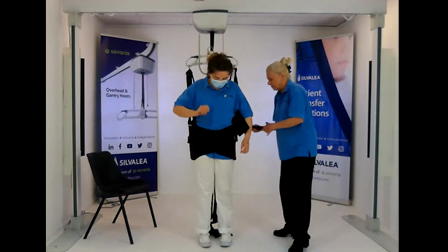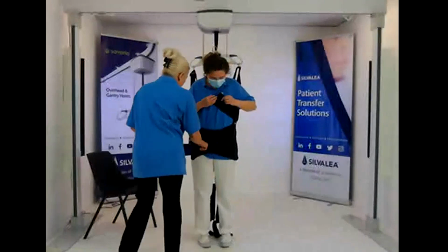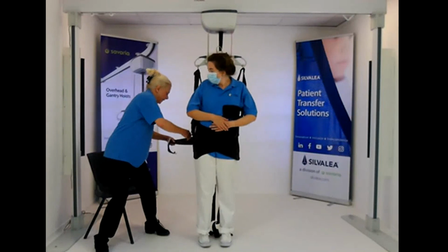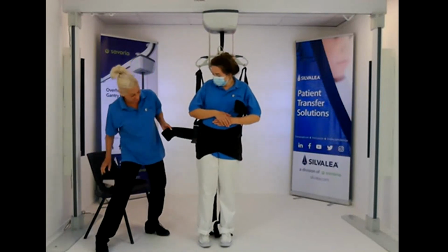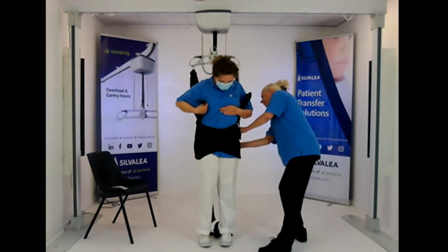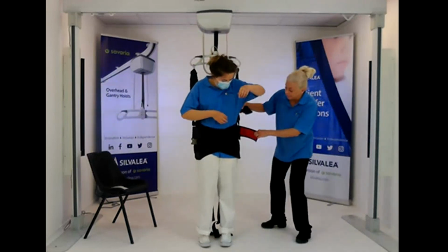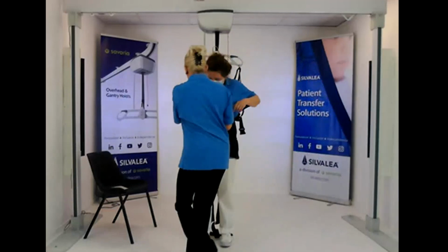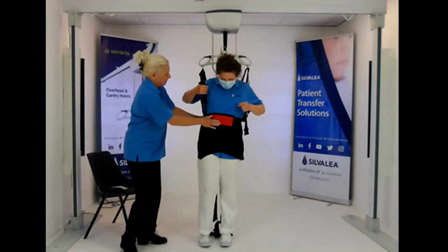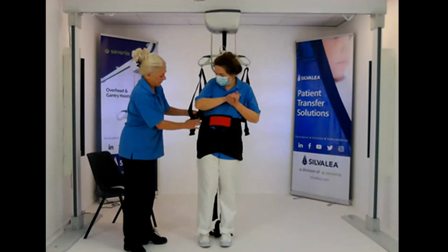And then the patches, which are color coded, I'm going to brace yourself, pull it around to the opposite patch of Velcro on that hip and repeat it. There's a patch here, take the protective patch off, then pull that round here. So that's one section. There's a red section that then comes under the bust, so just building it to give support there. So we've got that tucked in.